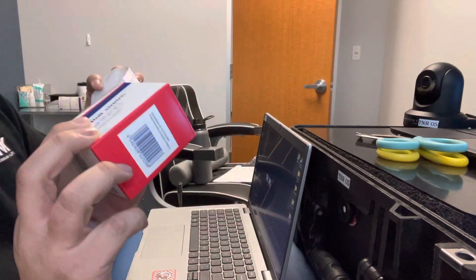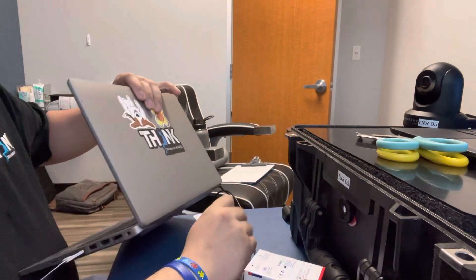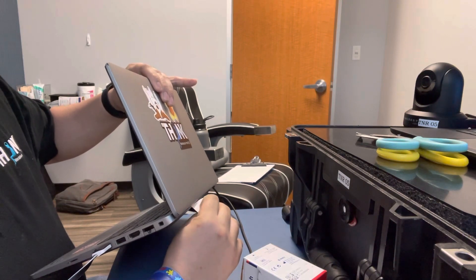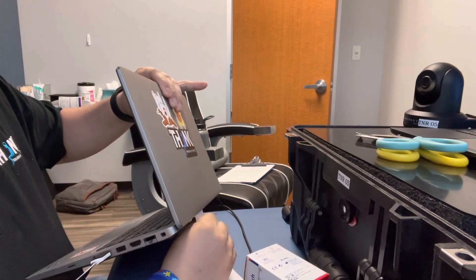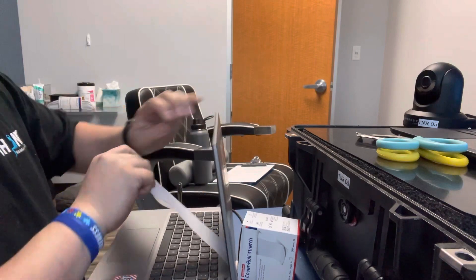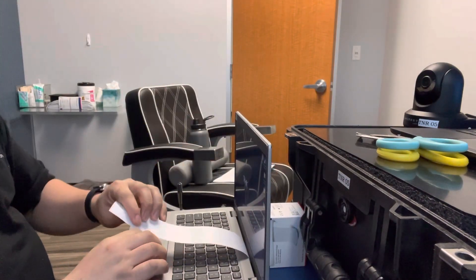So let me show you how — this box right here, you get your tape, you insert it in this little space right here in between. You pull it through, make sure it's secure in the back, you lock it in.